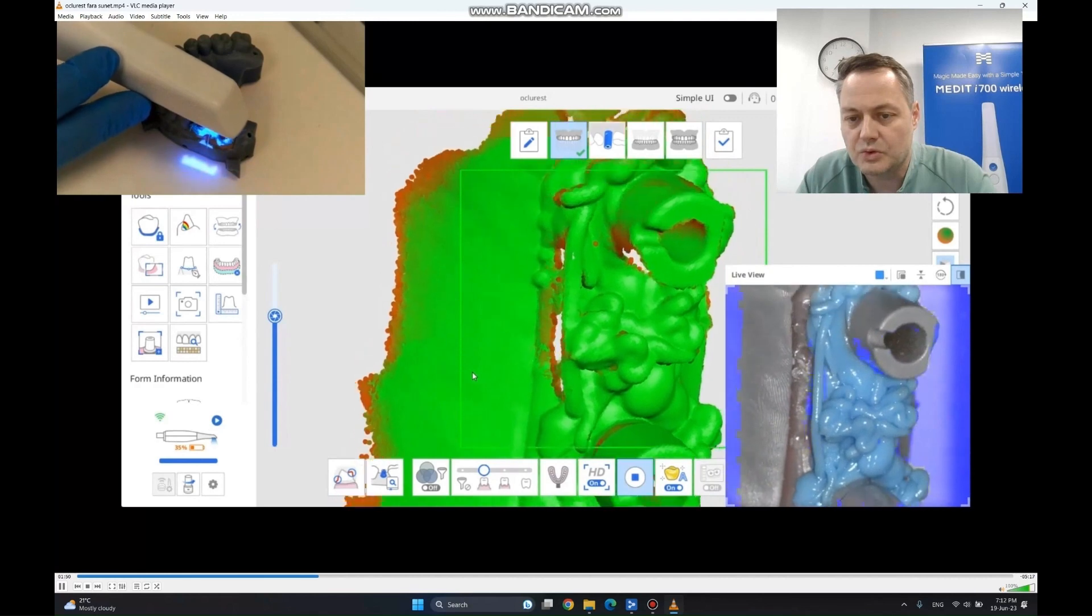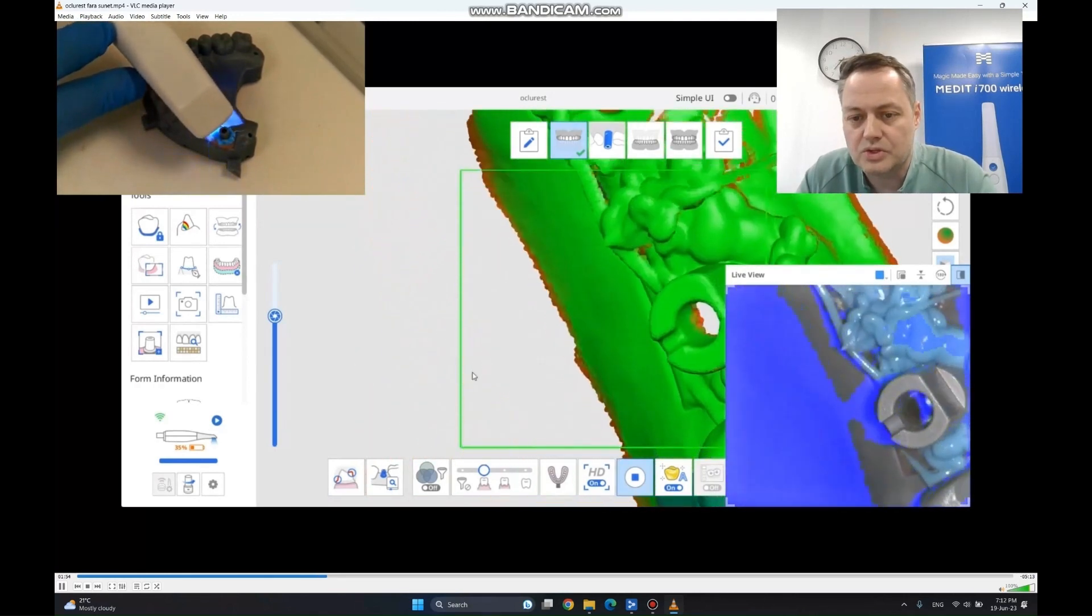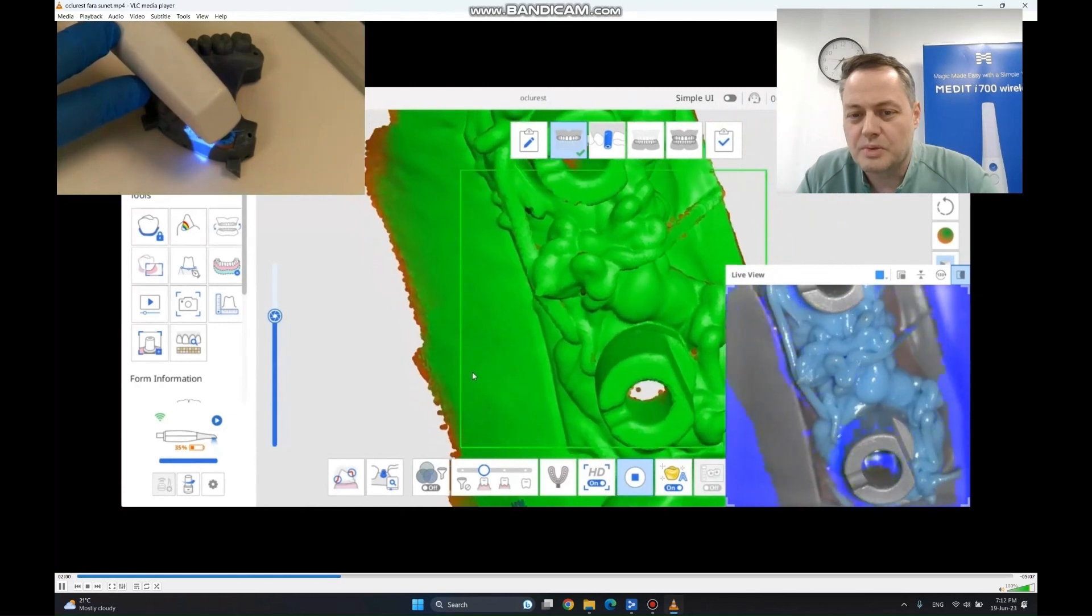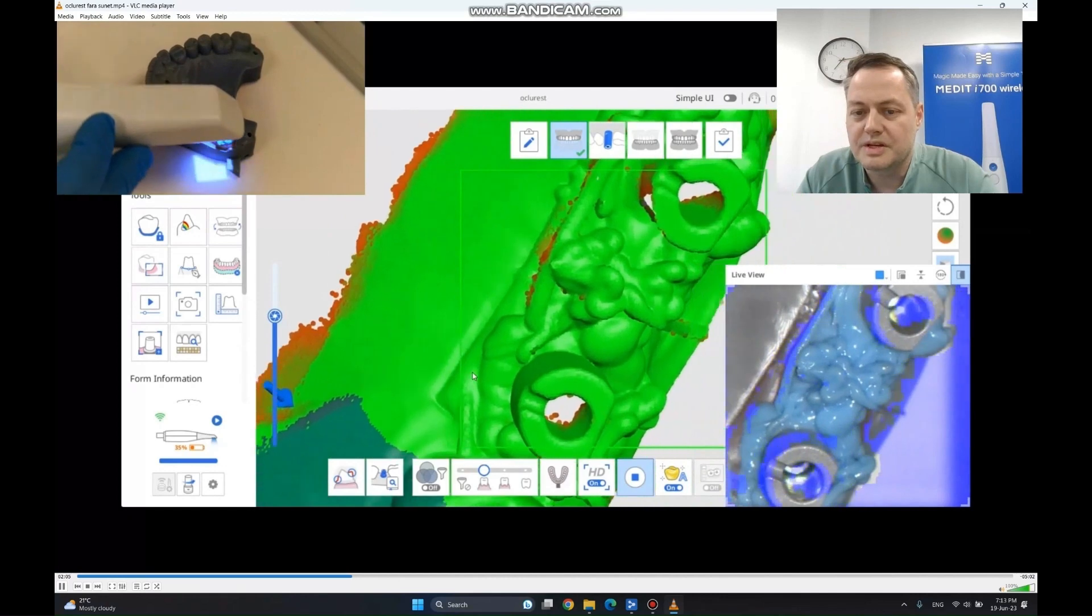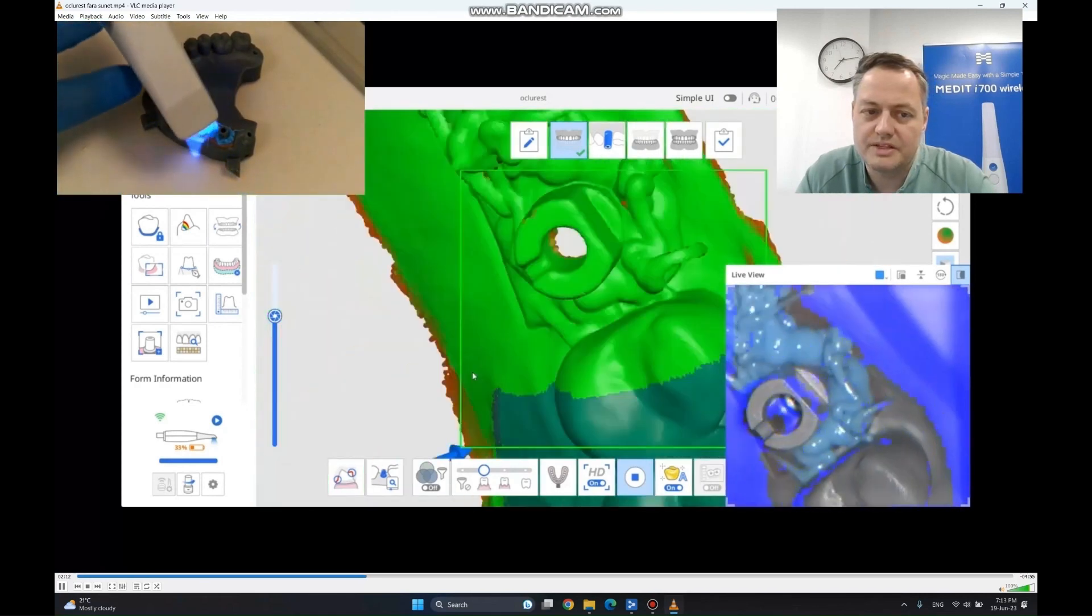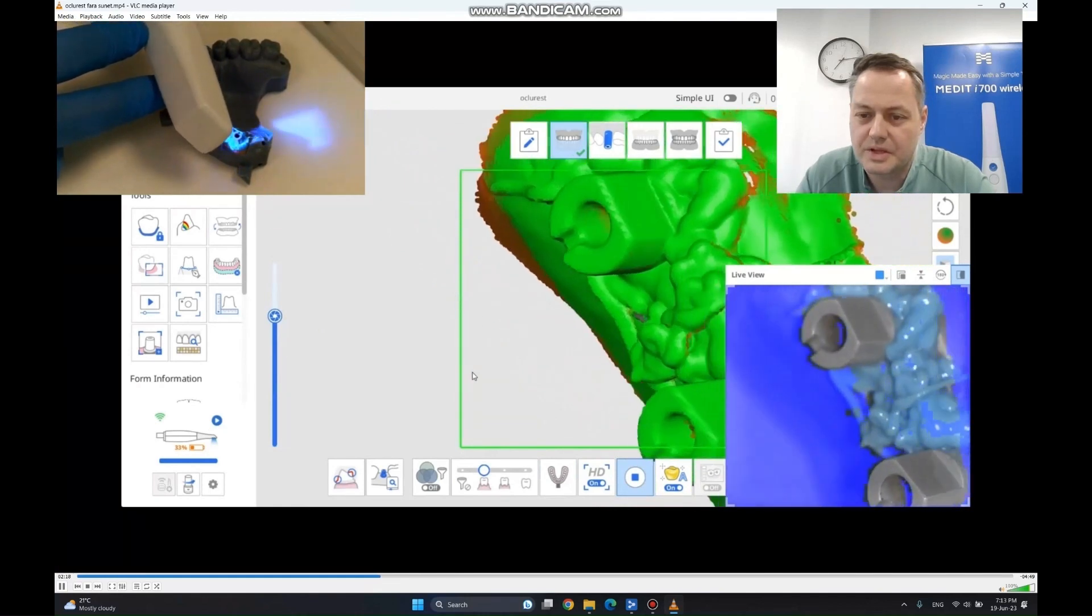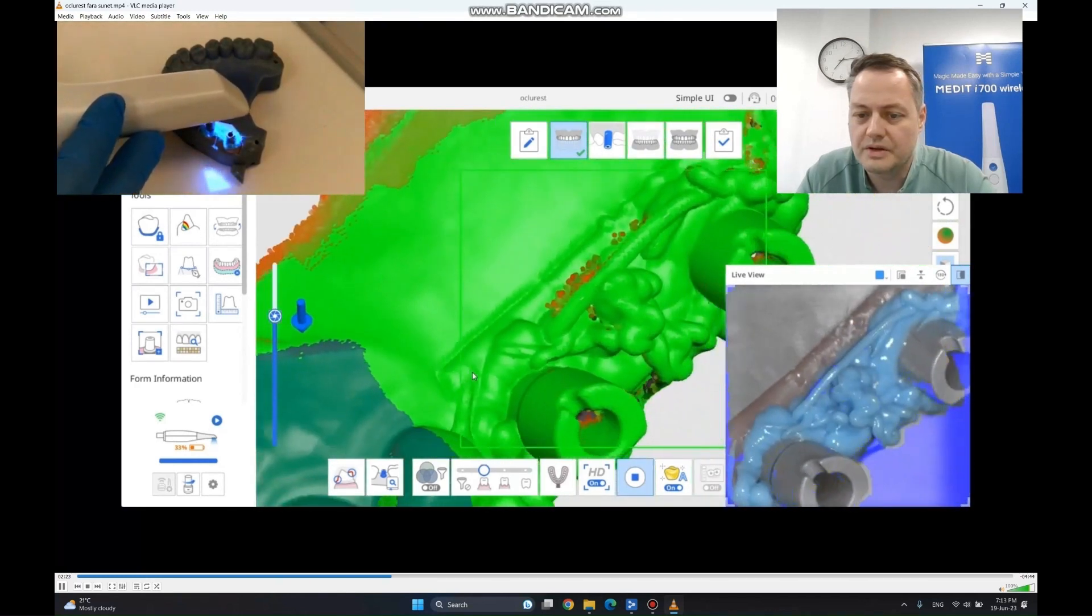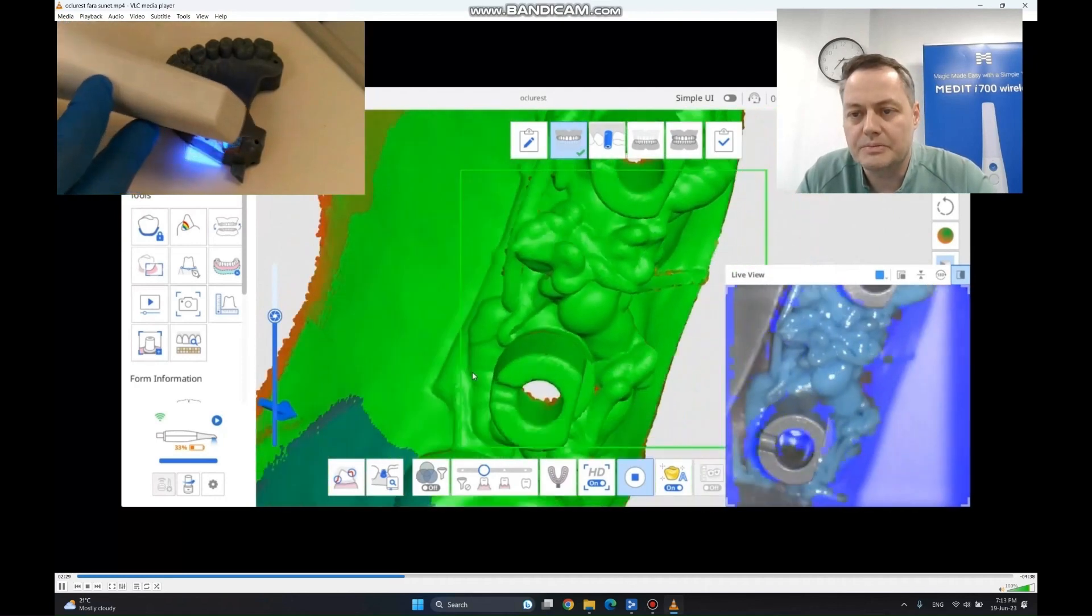To get the second one, I'm trying to keep contact with the first one and lots of contact with the material that I've placed here. By doing this, it's going to be very easy to get the precise impression. We are going to try and angle the scanner from every side, as you can see on the upper left part. You can see how I did it and how I had my scanner. Right now we have the whole surface and we can stop.